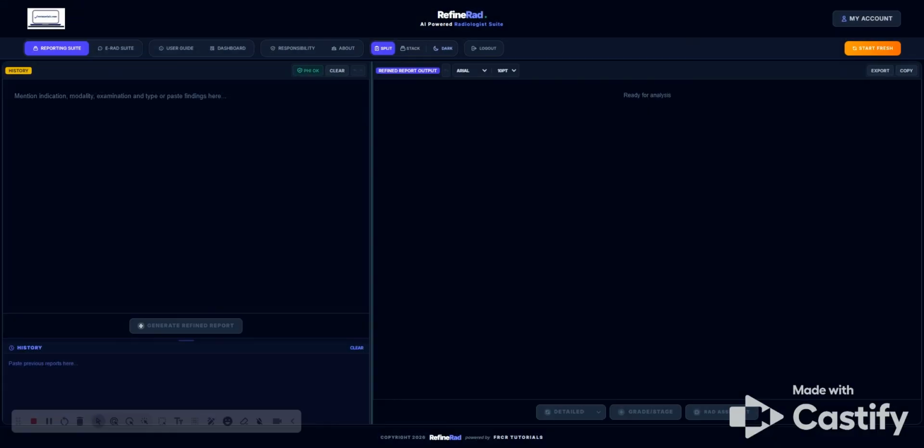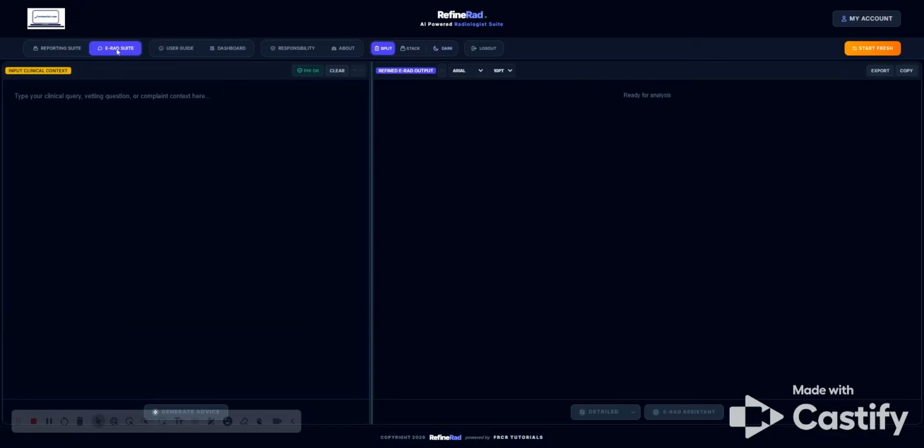Okay, and then I want to introduce you to the ERAD suite. So what is ERAD? The role of a radiologist is not just reporting in the UK. We get a lot of questions from general practitioners about what's the right type of imaging to do, or you're reporting in a duty radiologist session and the radiographer will ask you, I have a patient coming for a neck chest abdo pelvis, he had a little bit of an allergy last time, what should I do? Or for a CTPA and the eGFR is 23. So lots of similar questions.